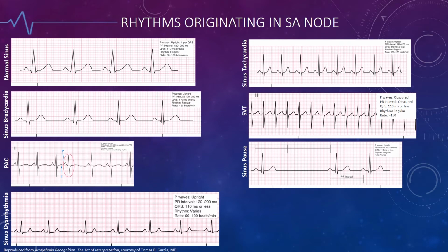What's the difference between the two? How do you tell the difference on an EKG? Ventricular contraction is going to be wide. That's right. A PVC is a wide beat. That's more than 3 little boxes. If the QRS is wider than 3 little boxes. A QRS should be less than 3 little boxes. Okay, less than 120 milliseconds.